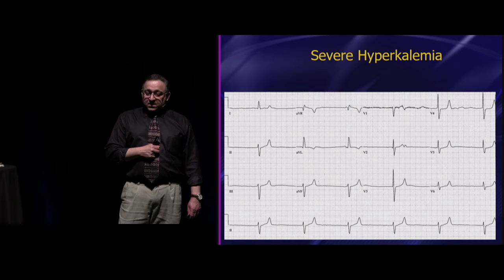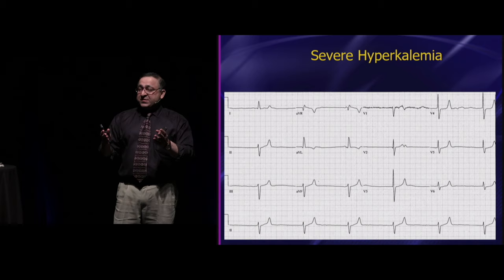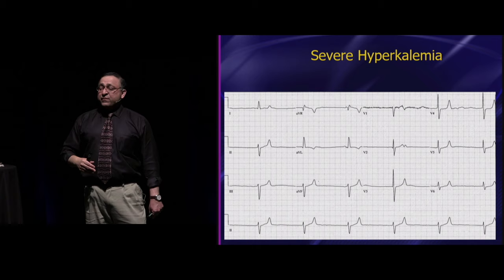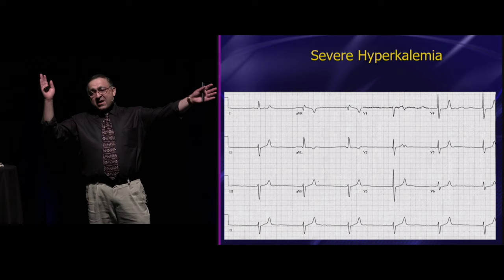So at this point, they're ready for transvenous pacing. They call up to cardiology because for whatever reason, there's no transvenous pacers in the ED. The cardiology fellow calls down and says, all right, no problem, I'll bring a transvenous pacer down. In the meantime, put a cordis catheter in, and when I get down there, we'll float a transvenous pacer together. So the residents are high-fiving each other. Yes, we're going to get a transvenous pacer and a cordis out of this.